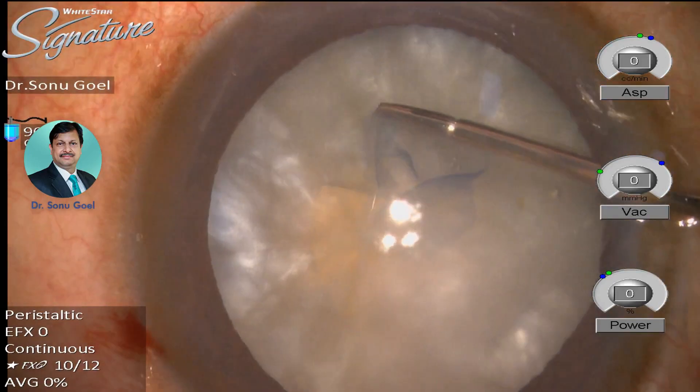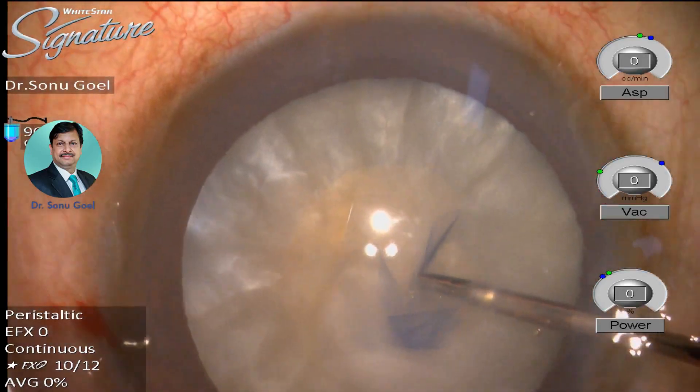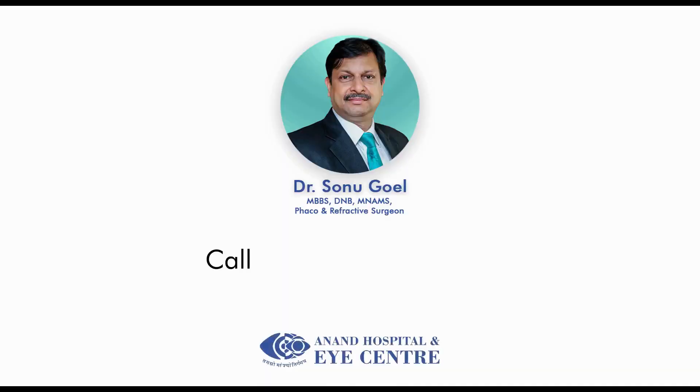In our experience, this is a great tool for managing white mature cataracts.